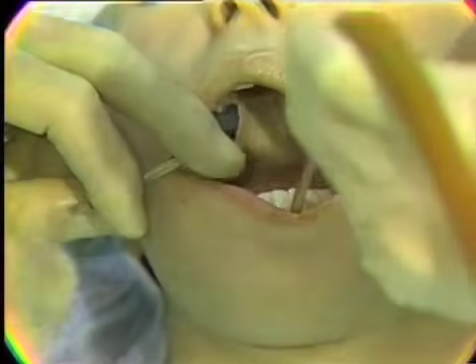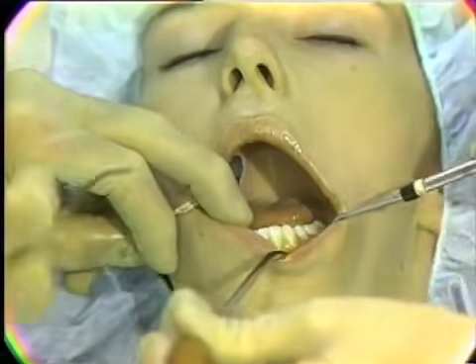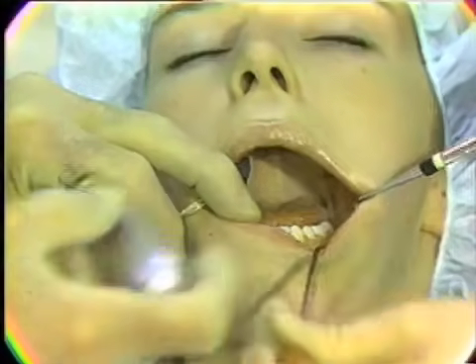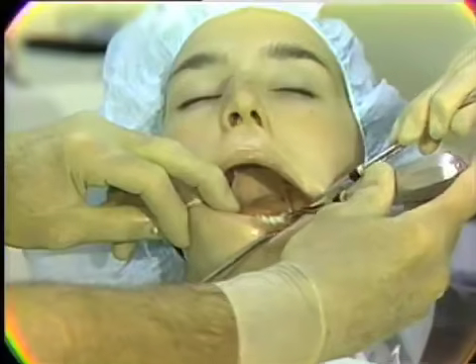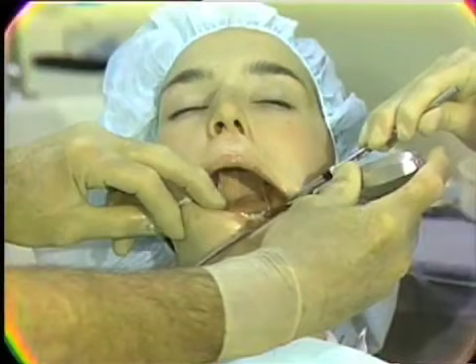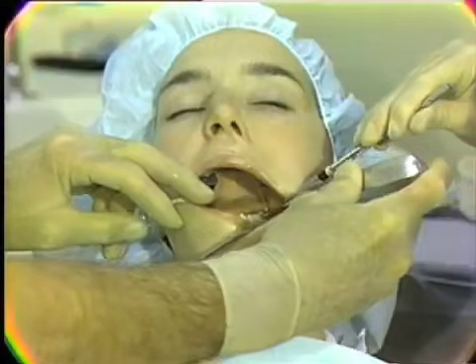And then as we're utilizing an elevator, say in the back part of the mouth, if we were going to place this elevator in this manner and rotate, we'd tell the patient to bite down firmly at that particular time when we're exerting force.